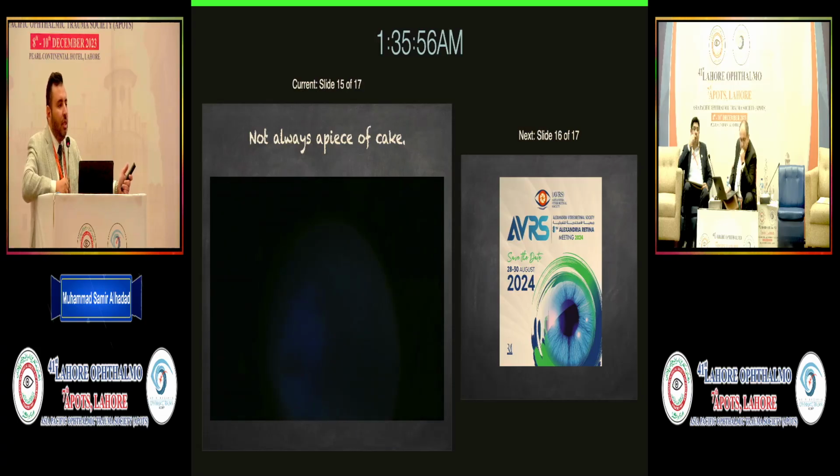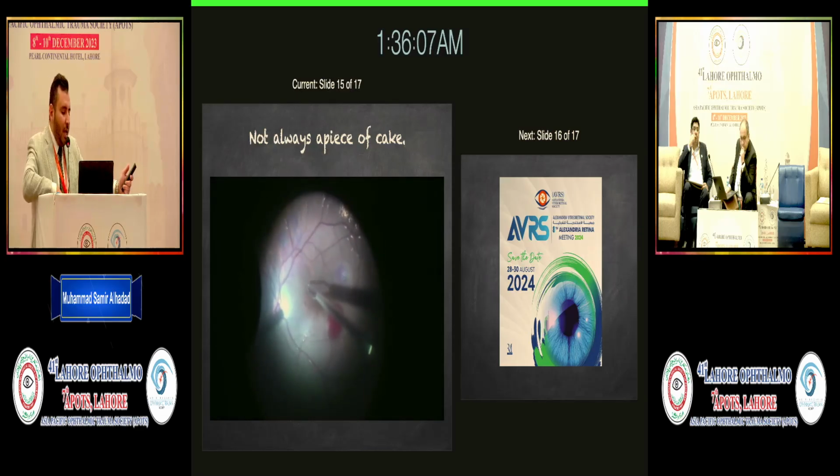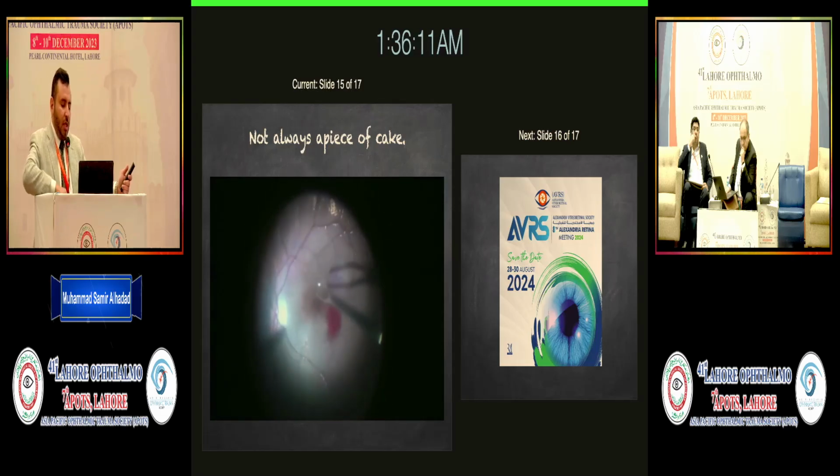How to deal with this situation? I injected BBG, and I did, as we are going to see in the video, a macular rhexis, ILM rhexis, and left the patient on gas, on SF6, as we are going to see here.